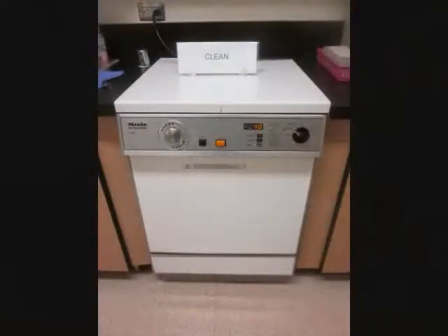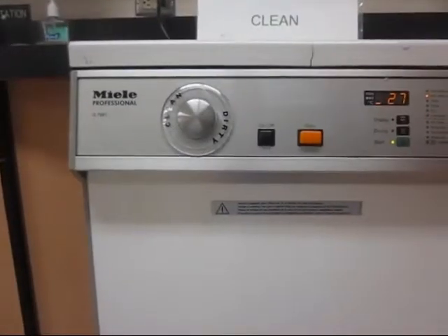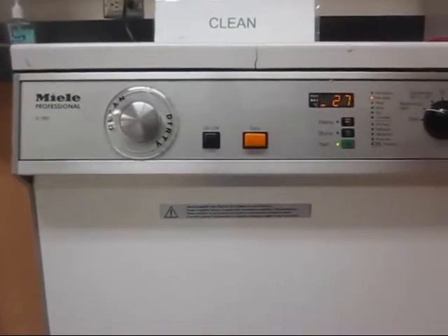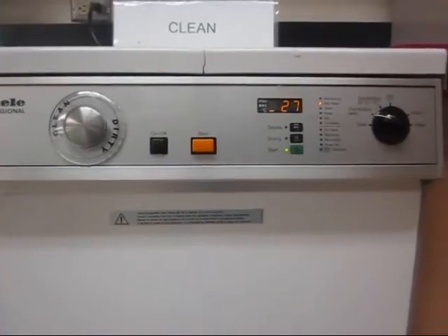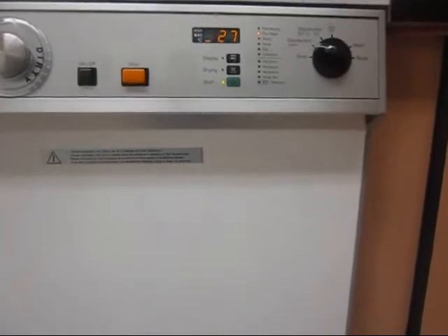The Miele G7881 Disinfector. This marvel of German engineering is equipped with sound dampening insulation, quad filtration, and a stainless steel finish. The multi-spray design is capable of shooting over 100 gallons of liquid per minute, and is equipped with four unique dispensing mechanisms for detergents and rinsing.